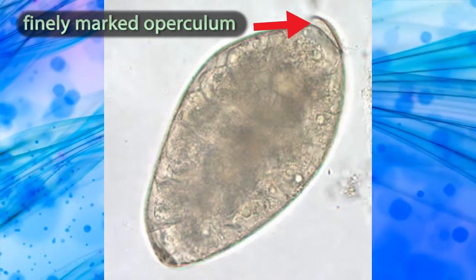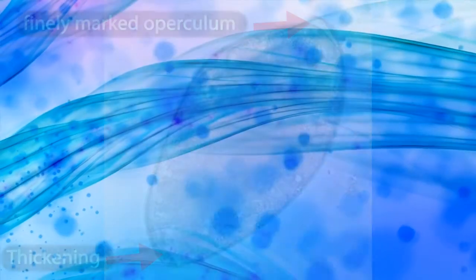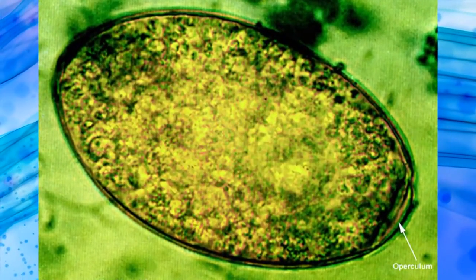There is a finely marked operculum at one pole, and a thickening of a small part of the cell wall at the other pole. The cell wall may be visibly retracted.